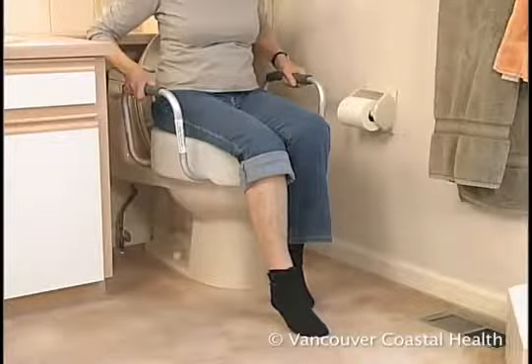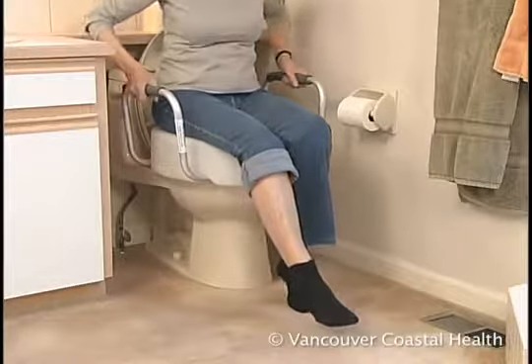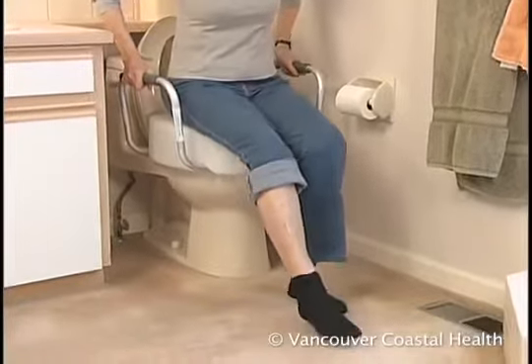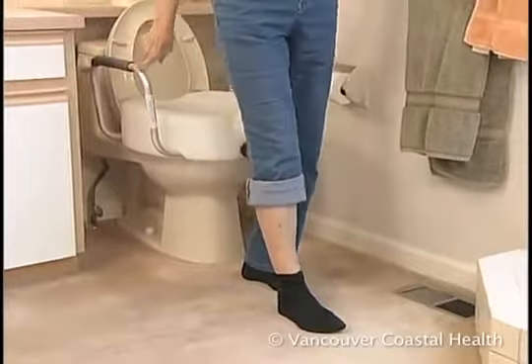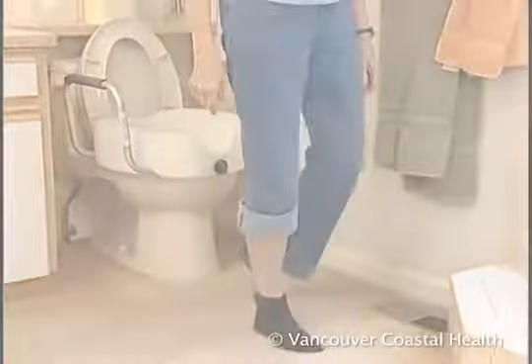To get up, slide forward on the seat, extend your surgical leg, then use your good leg and arm strength to push up. Make sure you press up on both armrests so that the device remains steady.